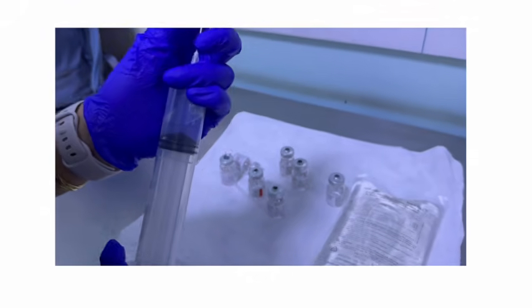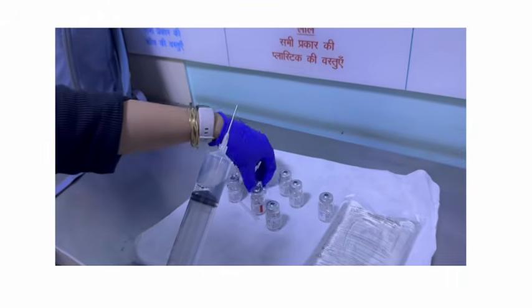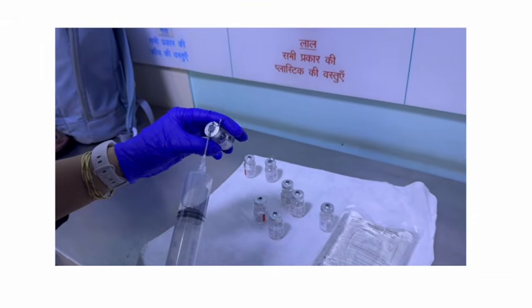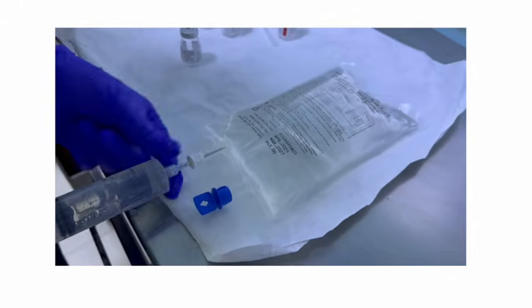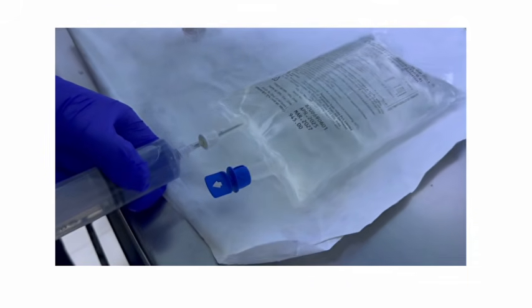So in the initial step of the procedure, we are mixing approximately 40 ml of trisodium citrate from these bottles with the HES solution, hydroxyethyl starch, which is a 6% solution, to make a citrate based anticoagulant.